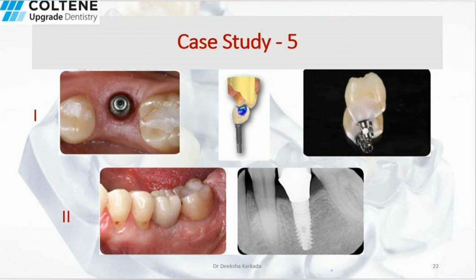This case study is of an implant placed lingually due to the normal resorption of the buccal plate. The design of the crown is pseudo-pontic to decrease the oblique load on the crown. A hybrid implant crown was made with BRILLIANT Crios, cemented adhesively on top, ready to be screwed in the mouth. The image here is of the implant crown after 1 week of placement, and also the IOPA is of the implant crown after placement.